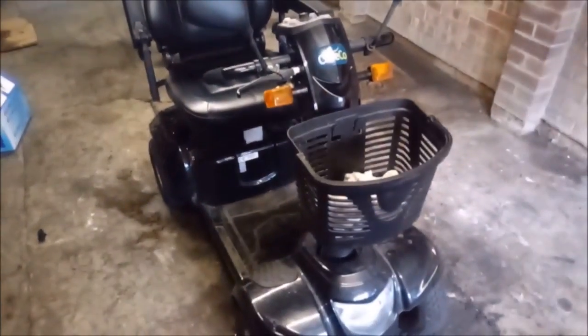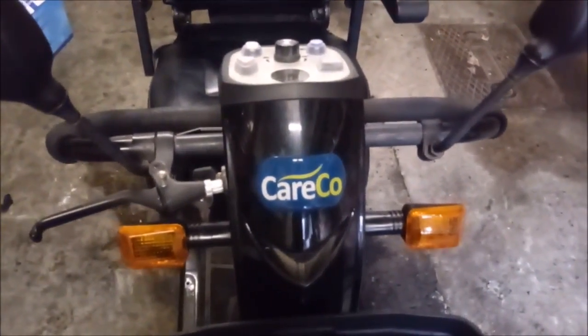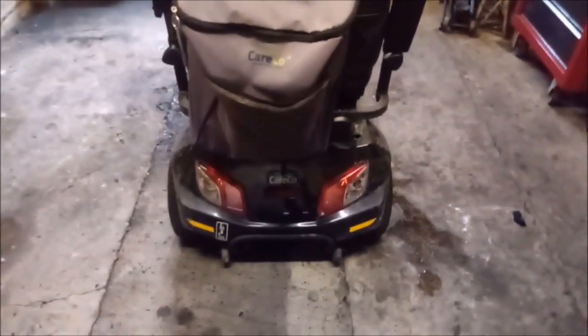Right, here's the kiddie. As far as I can tell, it's a Careco, Car Care, 4-wheel mobility scooter. Luggage rack on the back, indicators, lovely, lovely. All the creature comforts of home.